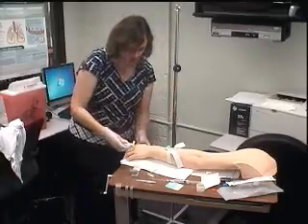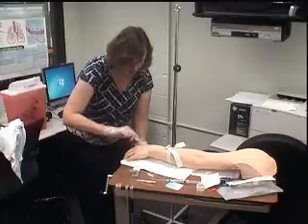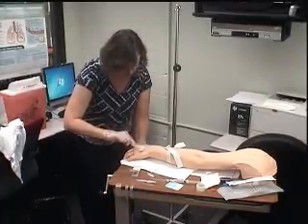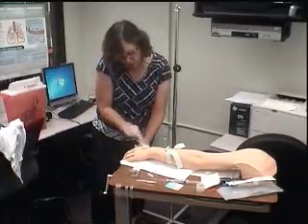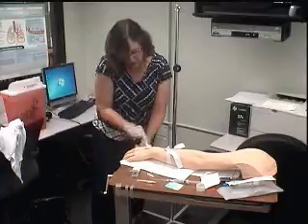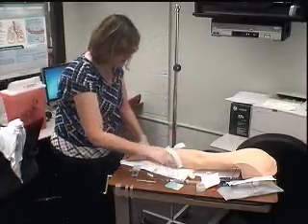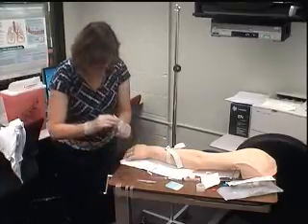So we do this and we hold and we clean that area really well by scrubbing it with this liquid ChloraPrep. Scrub one way, scrub the other way. And then let it dry. This would be tossed. All right, so I've decided that it looks good. I can't touch it anymore.